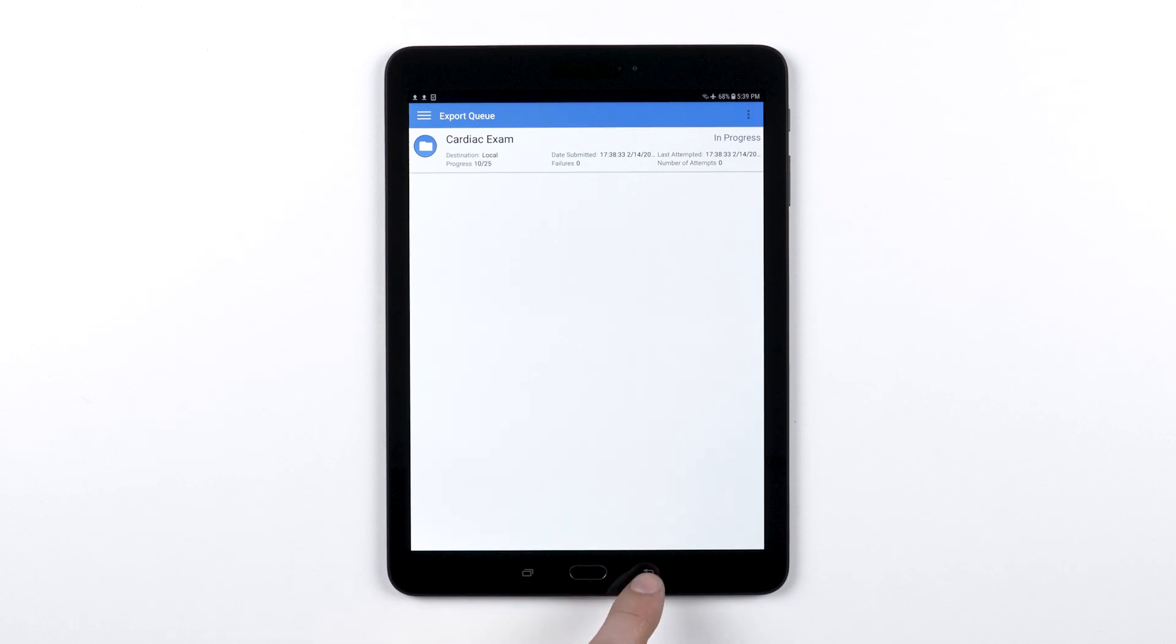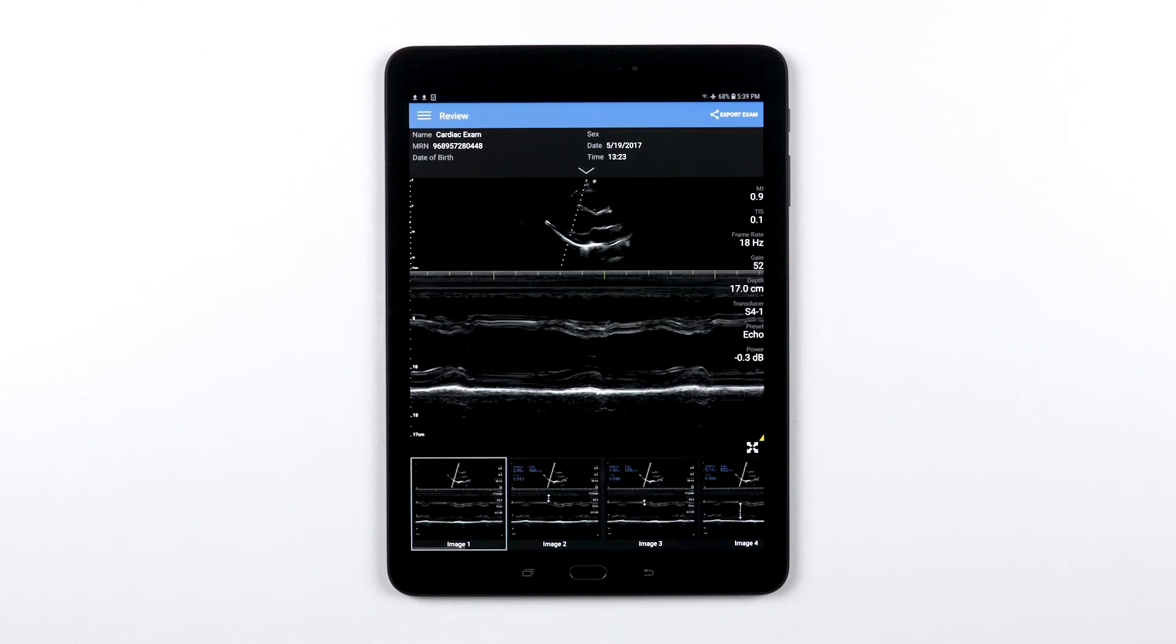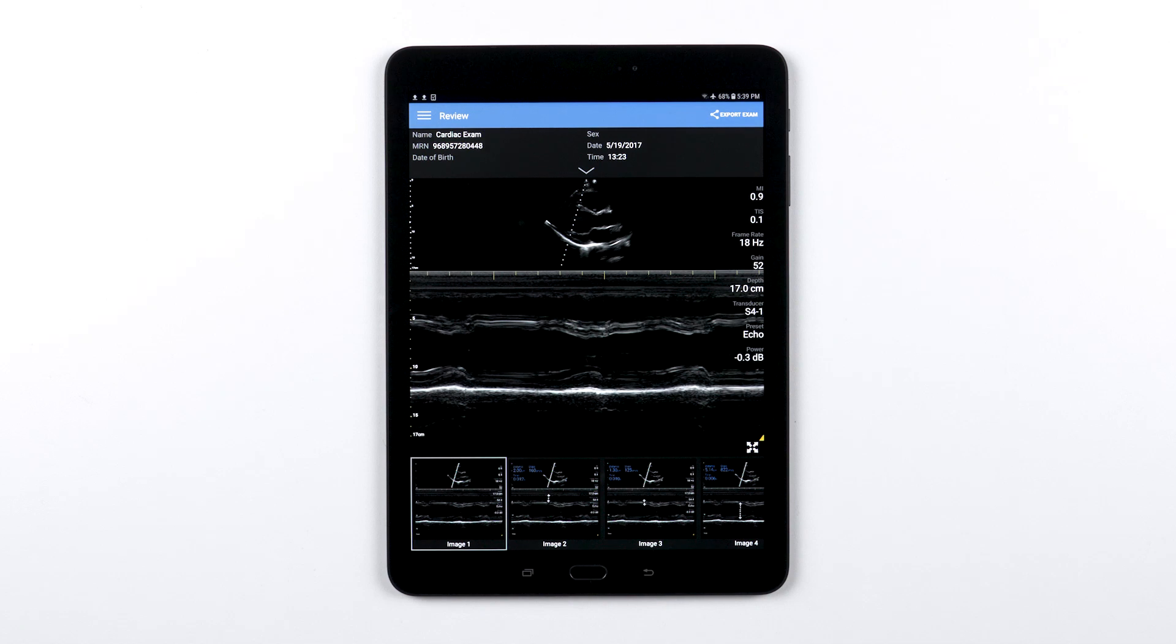If you export to a local destination, that means it's exporting your exam into a folder on your mobile device. Those exams can be transferred from the tablet in two ways.